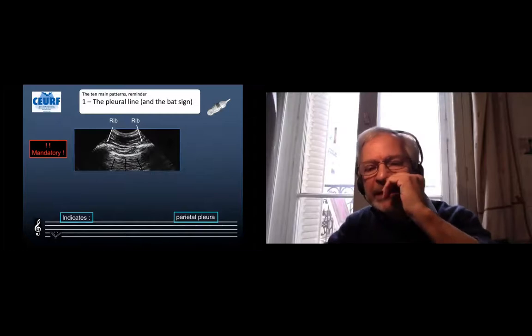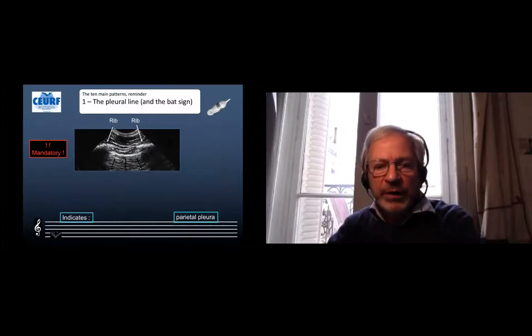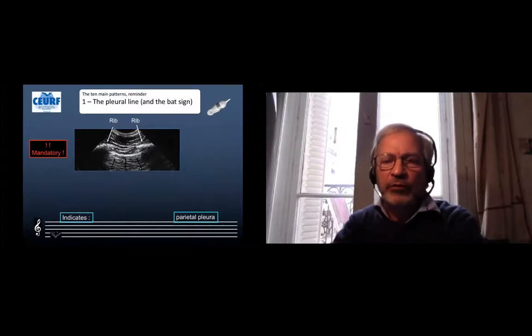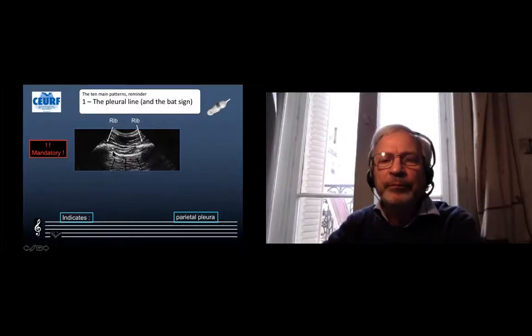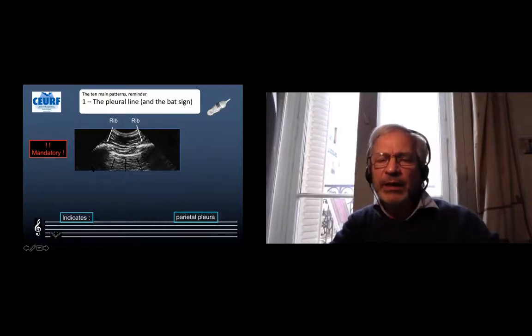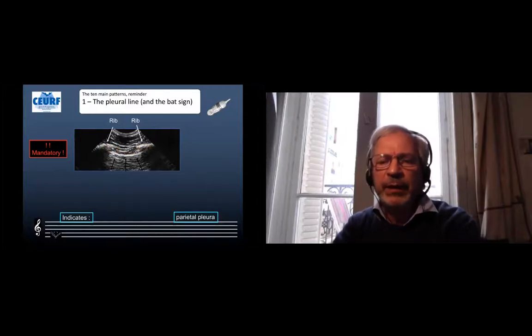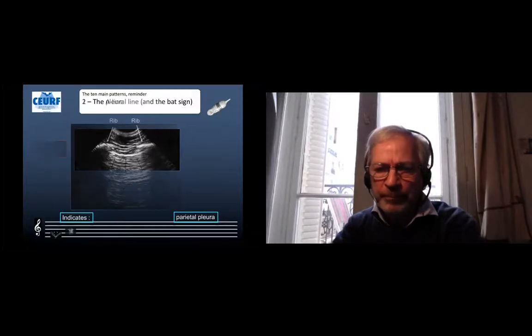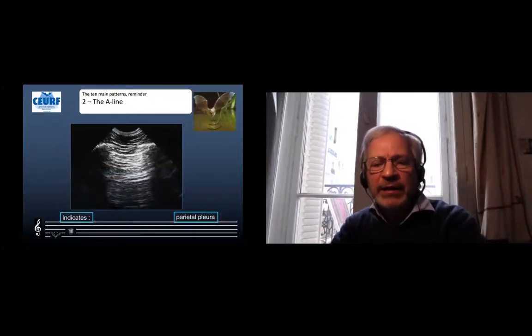That is a short axis of the ribs showing the parietal pleura, which is the pleural line here making with the shadow and the surface of the ribs. The bat sign indicating we have the parietal pleura for sure.